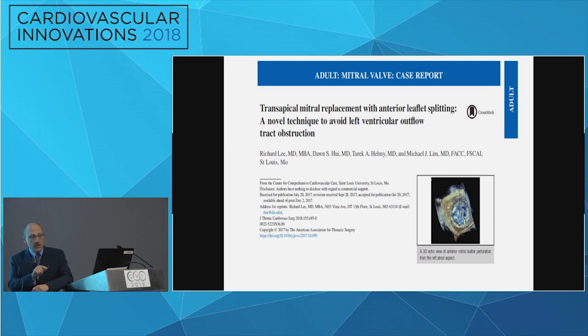Because we did this on cardiopulmonary bypass, we did not see any tenting of the subvalvular apparatus. We believe that if you do this under rapid pacing, which you would usually do, you would not have a risk of significant atrial migration of the subvalvular apparatus. We would position it right at the annulus and anchor the Sapien at the annulus without significant pull.